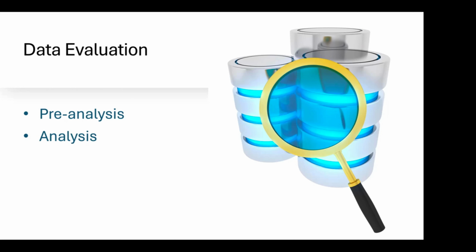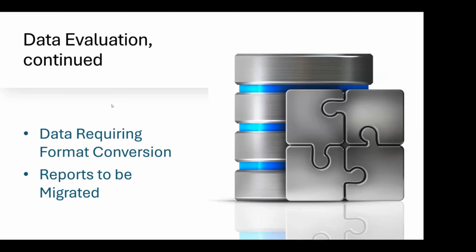Doing some analysis, typically using the data migration tools of the provider at the start of the data migration process. For each data source, they'll do an inventory of the data and basically report, here's what is in that source system. And it's usually advisable to conduct some analysis on that actual inventory for things like missing or invalid attribute values, common ones like patient ID, accession numbers, and even just inconsistent ones. So if they don't match the schema that you use. I've got a couple slides left, and then I'll hand it to Mike.